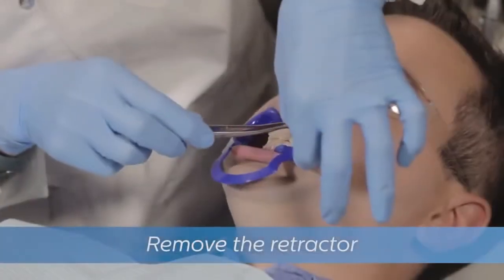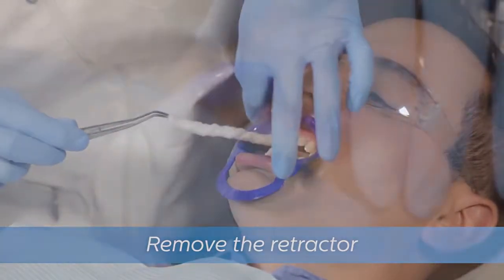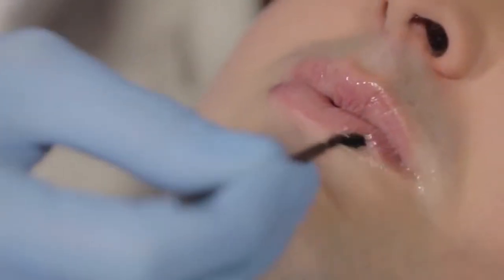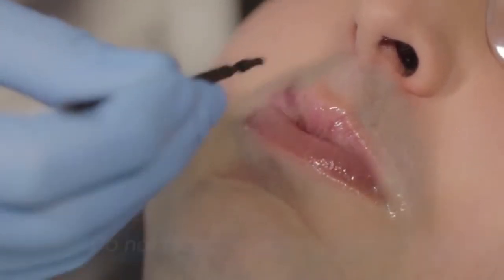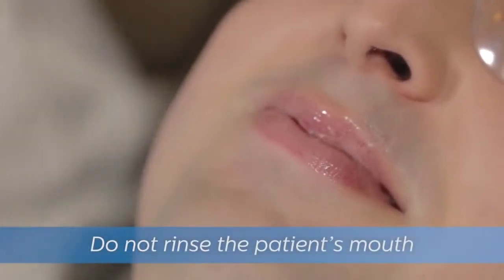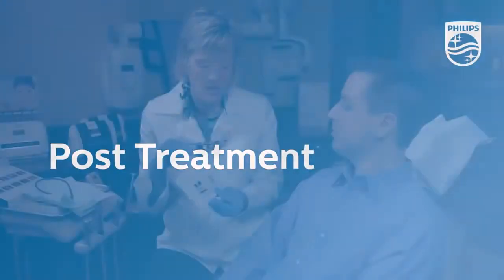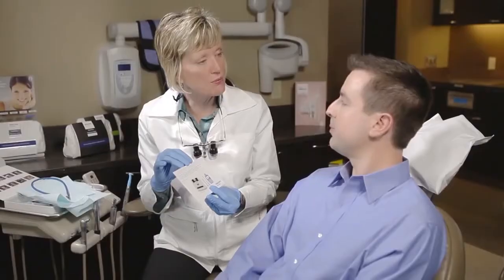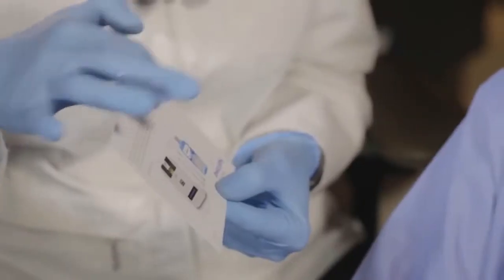Gently remove the cotton rolls and retractor and apply another layer of vitamin E oil to the patient's lips. Do not rinse the patient's mouth — the procedure is now complete. Give the patient the provided post-care instructions and make sure they know they should wait 30 minutes before removing the varnish.